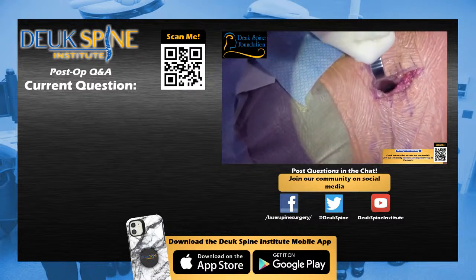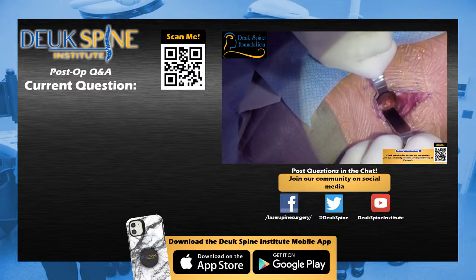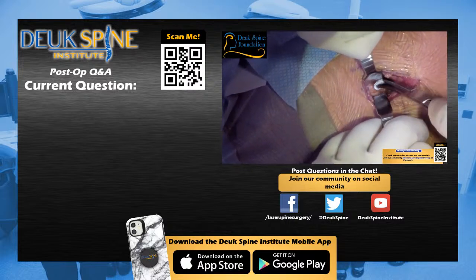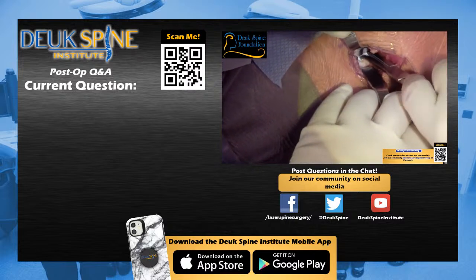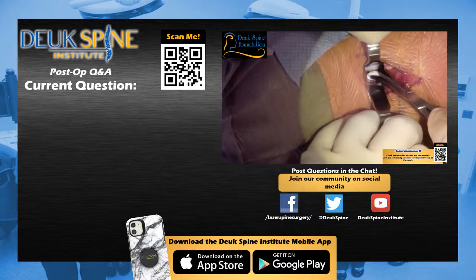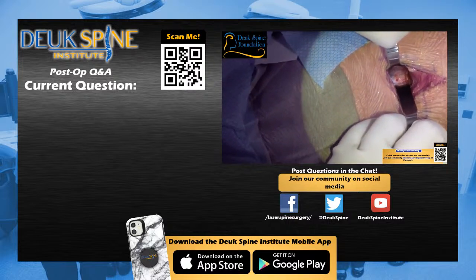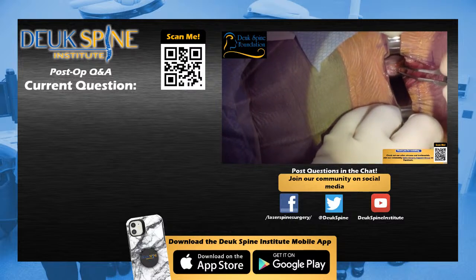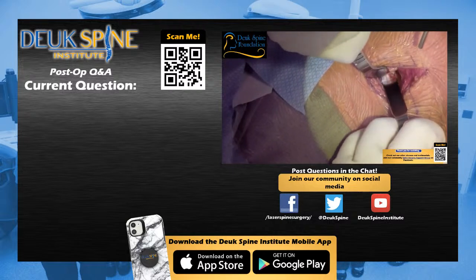Spine surgeons will usually try to make small incisions. Small incisions create more problems for patients, far more problems. When I saw the depth of this patient's neck, when I saw the limited visibility with the x-ray to verify where we were, I realized we needed a bigger incision right away. And so we did an oblique incision along the medial border of the sternocleidomastoid muscle, which gave us excellent visibility, gave us safe exposure, and much less retraction on the blood vessels and the esophagus. So it was the right choice.